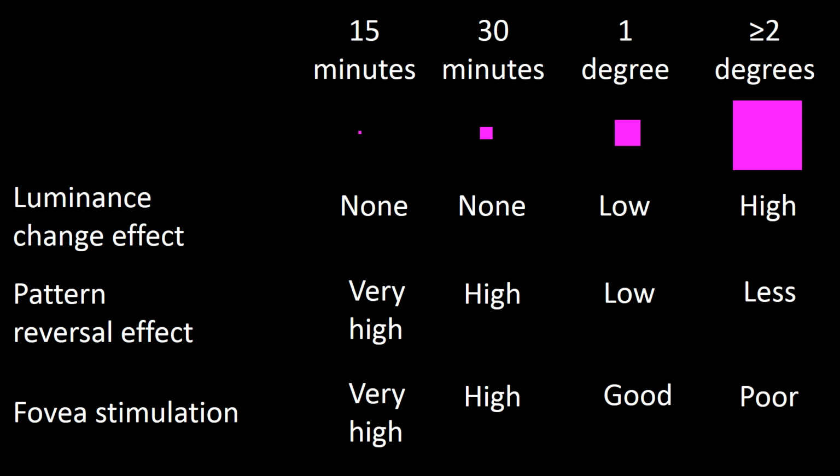The effect of pattern reversibility is likely the consequence of fovea physiology. Small checks, when vision of the subject being tested is good, produce major changes in the wave as a consequence of pattern reversibility. Large squares, since they may cover the complete fovea as a homogeneous structure, produce less of a stimulus in the fovea.